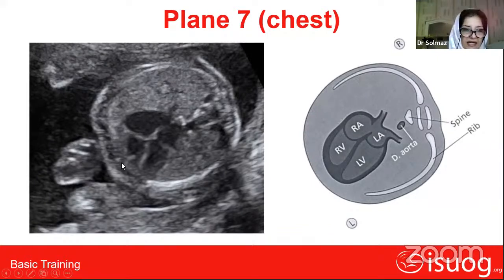They have a gray color and we can't see any fluid filled area either around the lungs or around the heart, i.e. no pleural or pericardial effusion. And in this schematic presentation, you can also clearly see the descending aorta, which is the most consistent structure signifying the left side of the chest. It's important and it's nice to have this in mind.